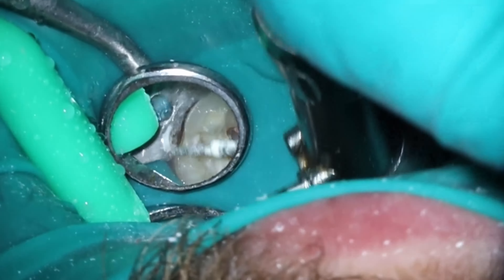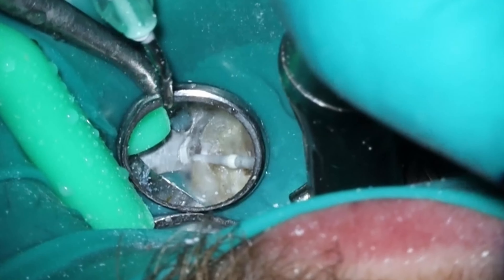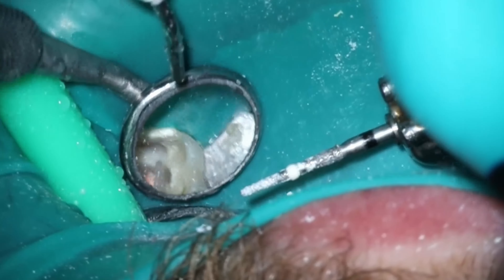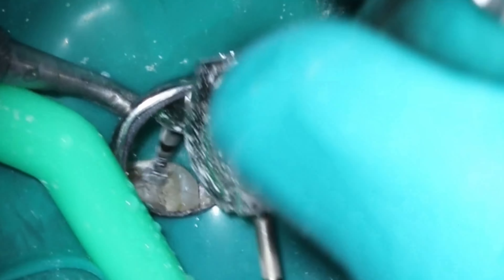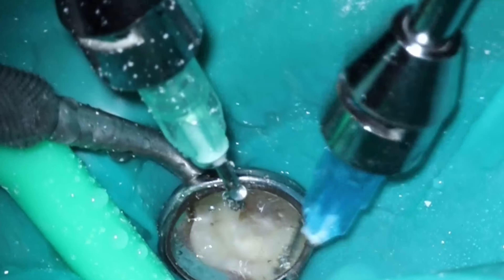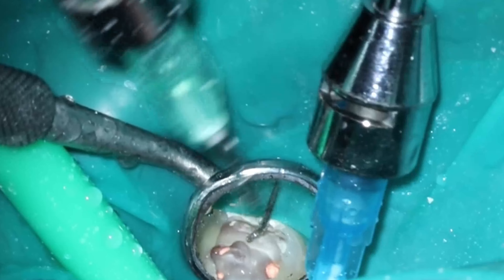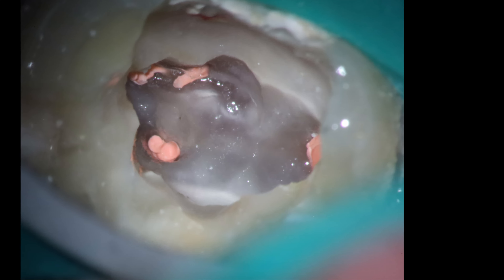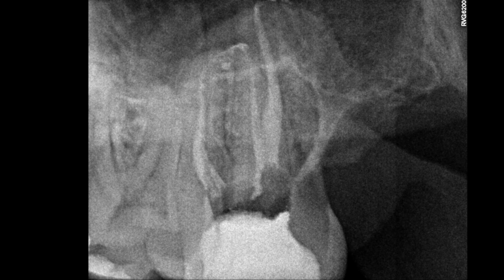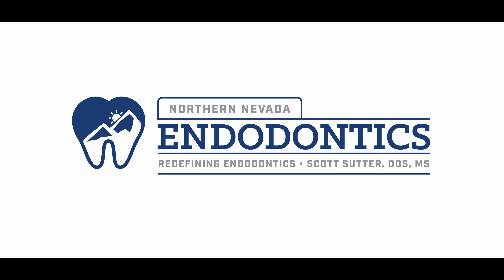It does not take long to take a big round bur and zip this out. I'm switching to the workhorse here for a couple of them because the angle's kind of weird and I don't want to remove that much tooth structure. At this point we really just have to temporize, make sure everything's clean, and get the rest of that IRM out. This has been a long day — I'm leaving for Chicago tomorrow. But it's a pretty straightforward case. I thought it would be interesting just to go over: someone else started it, here are my thoughts, what could be better, what did they do great. All in all, I think the dentist did a really nice job with this one. There's the final pictures looking pretty — the MB2 everything's cleaned out, and here's the final image with the Cavit in there. Thank you all so much for watching. Please drop any comments or questions below, and I'll talk to you all next time.